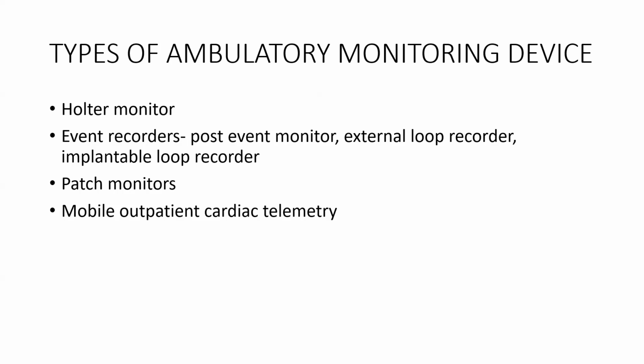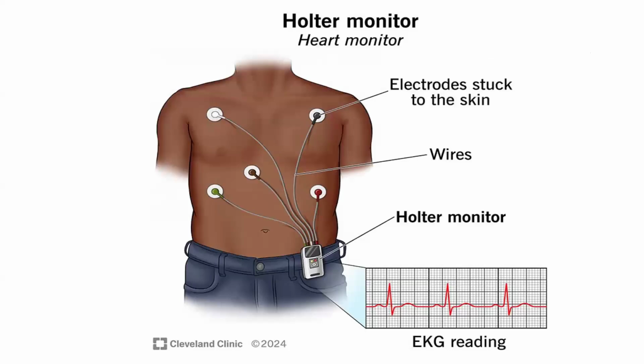This is what a Holter machine looks like.